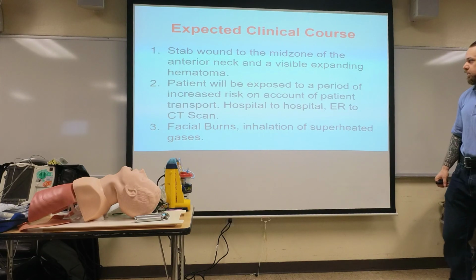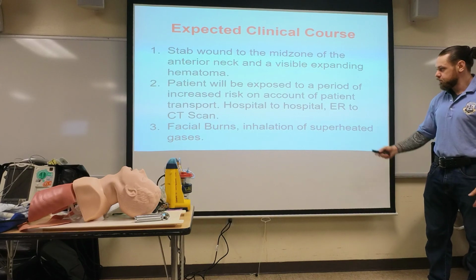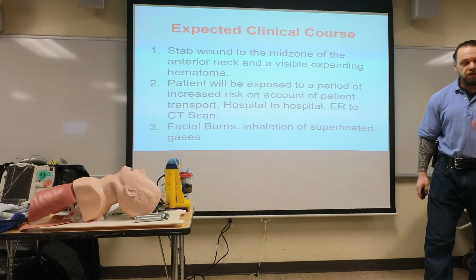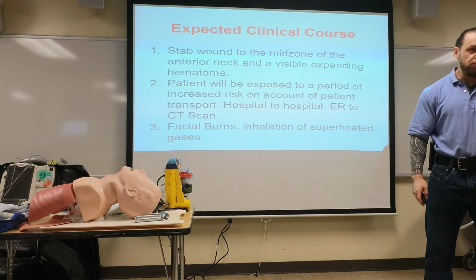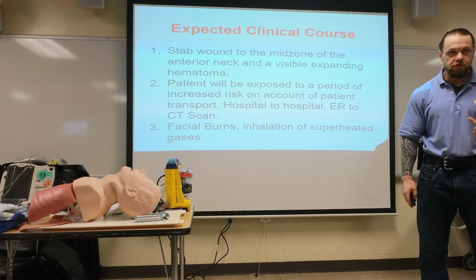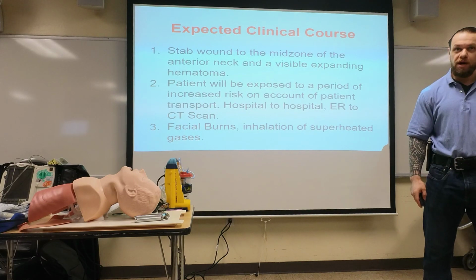The other one I told you was increased risk on the patient's transport, hospital to hospital or to the CT scan. And we talked about the facial burns, superheated gases. So just to sum up, what are the three indications for intubation? Failure to protect or maintain the airway, failure to ventilate or oxygenate, and expected clinical course to decline. Do you need all three? No, you do not need all three. One criterion is sufficient.